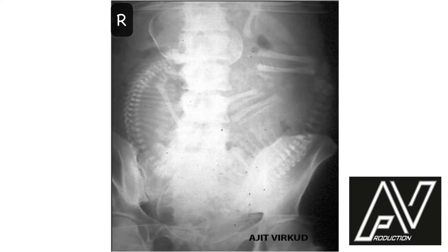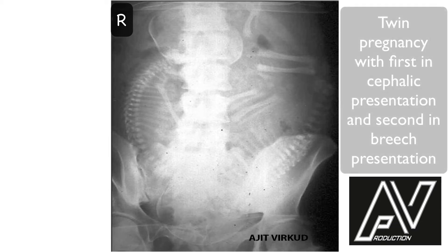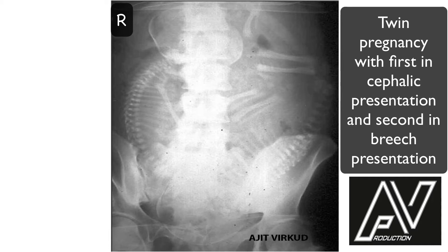This is a plain x-ray of the abdomen and pelvis, AP view, not well centralized, well exposed, showing two fetuses. The first twin is in longitudinal lie, flexed attitude, cephalic presentation with vertex as the presenting part. The second twin is in longitudinal lie, breech presentation with complete breech as the presenting part. The head of the second twin is well flexed. There is no discordancy in fetal size. There are no obvious fetal skeletal abnormalities. Therefore, my diagnosis is twin presentation with first twin in cephalic presentation and the second twin in breech presentation.